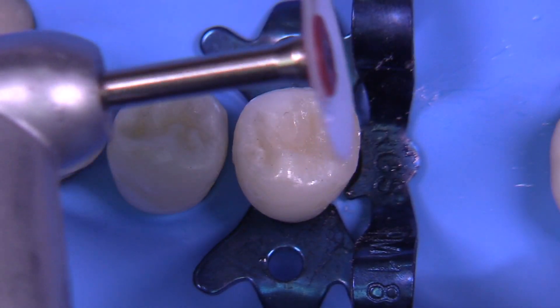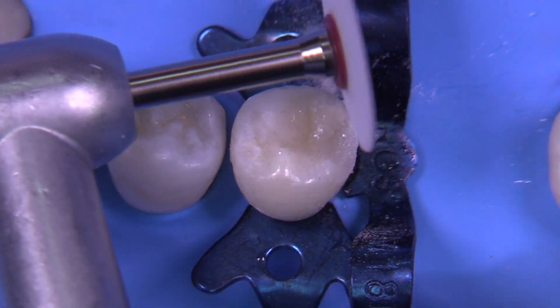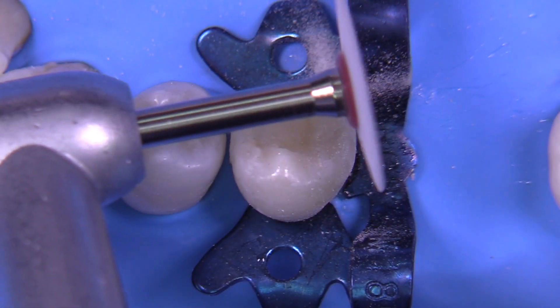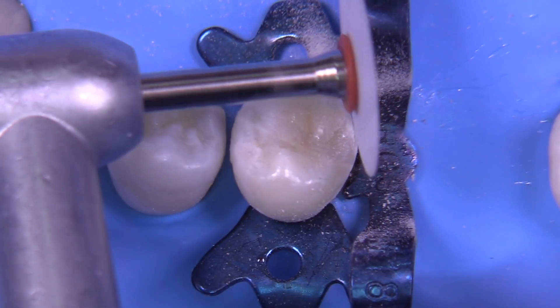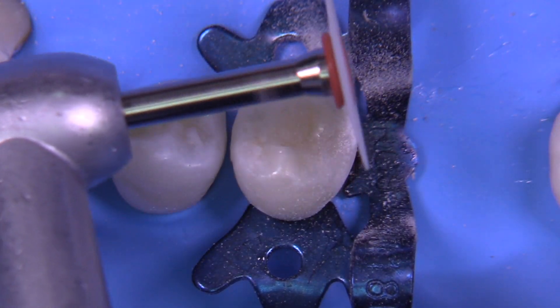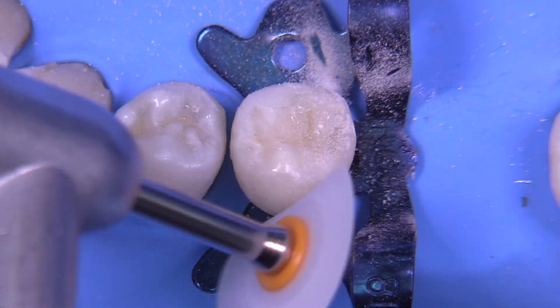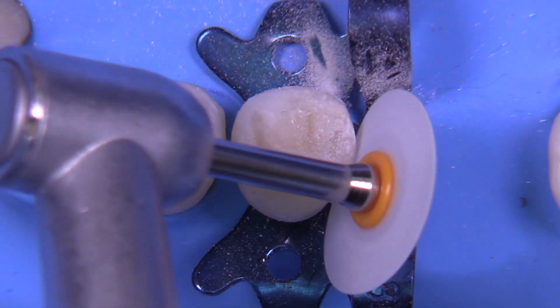Getting back to the tooth: we're going to use Opti discs — my favorite for the most part, just a great disc system. As the ISO requirement, they go from dark to light. We start with the darkest one — I refer to it as the plum color — and use it with the disc moving at all times, rotating from composite to tooth whenever possible. Use copious amounts of air spray or water spray to keep things cool and help prevent the white lines you often find when finished polishing.